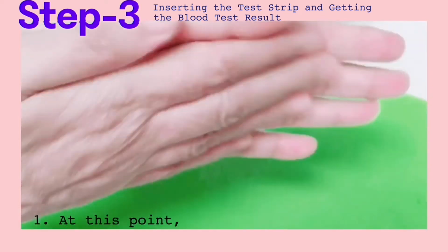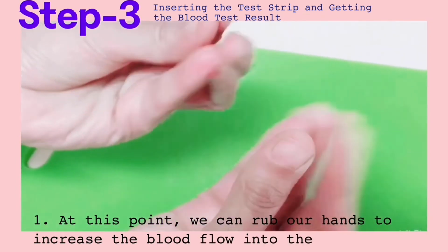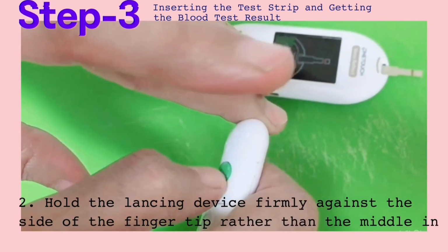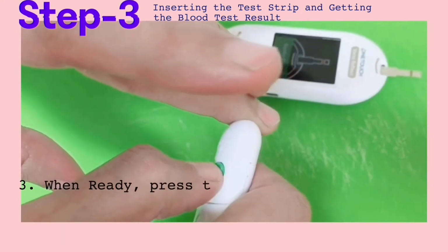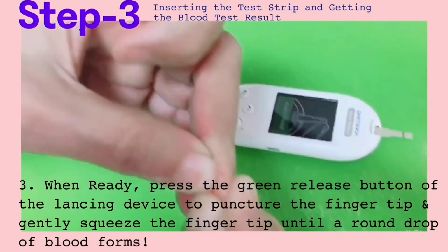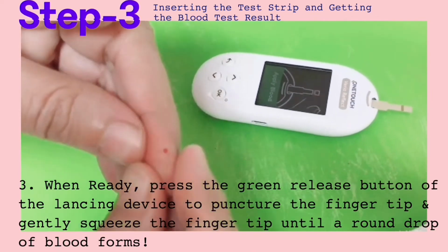So at this point, we can rub our hands to increase the blood flow into the fingertips. Then hold the lancing device firmly against the side of the fingertip rather than the middle of the fingertip to reduce the pain. When ready, press the green release button of the lancing device to puncture the fingertip and gently squeeze the fingertip until a round drop of blood forms.